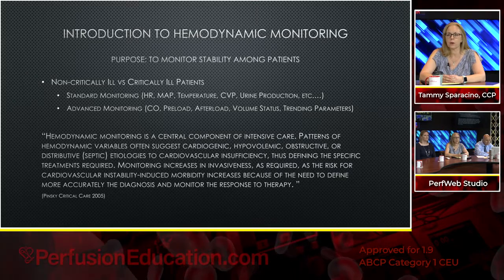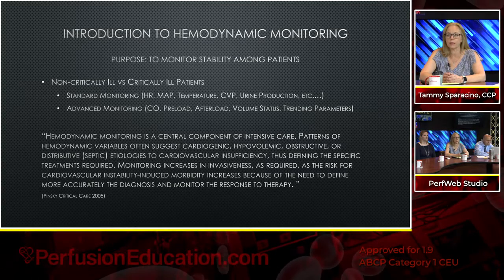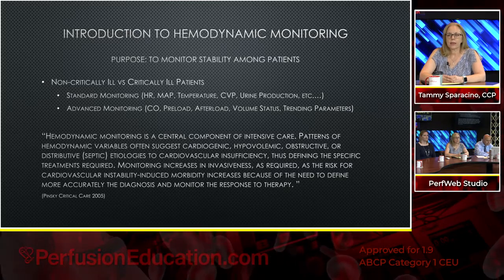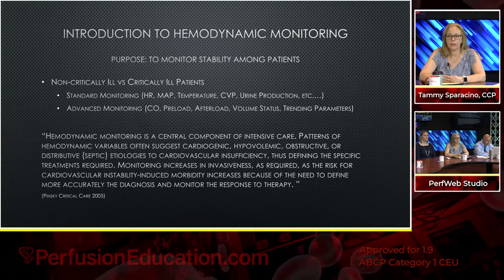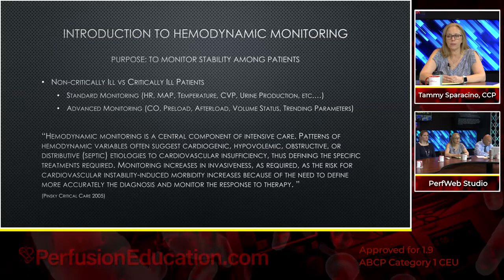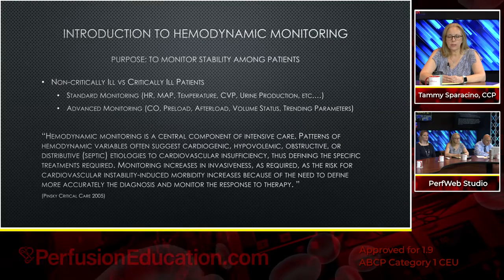Okay, I thought this quote from Michael Pinsky from Critical Care 2005 was wonderful about talking about hemodynamic monitoring and its importance. What he has to say is, hemodynamic monitoring is a central component of intensive care. Patterns of hemodynamic variables often suggest cardiogenic, hypovolemic, obstructive, or distributive etiologies to cardiovascular insufficiency.